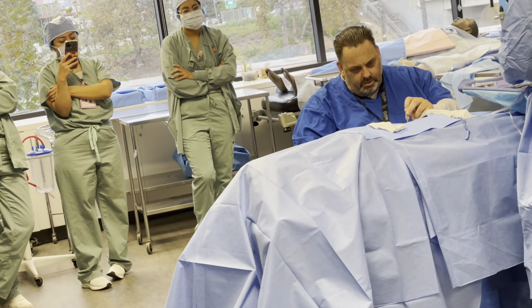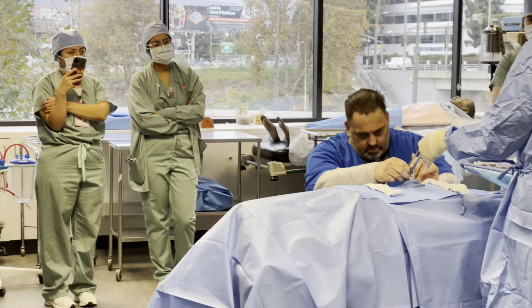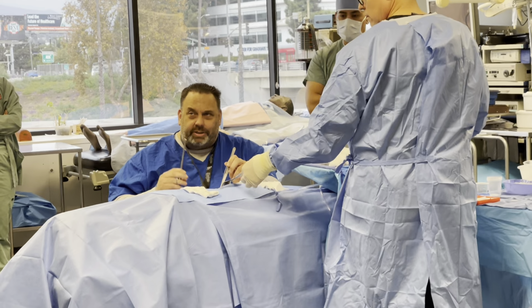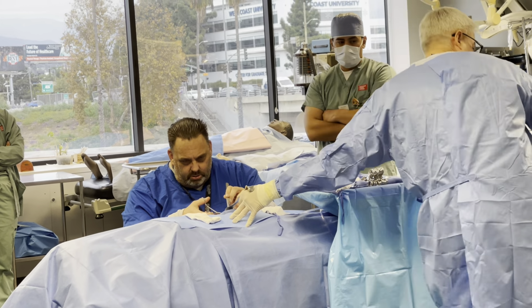Also, I don't know if you guys know this, but he asked me to hold the Goulet, yes? So I took it, and then he asked me for the Alice. So what I did was I anchored my hand via my finger the best I could, so when I did move, the retractor didn't move with me. If I'm floating with it and I go to move, guess what's gonna happen? You're in a pool. You're gonna be all over the place, and your surgeon's gonna be like, whoa, what are you doing? Your hands go where your eyes go. So if I anchor my hand here, I can go here, here, here, here without disrupting that. It's a little pro tip for you guys.